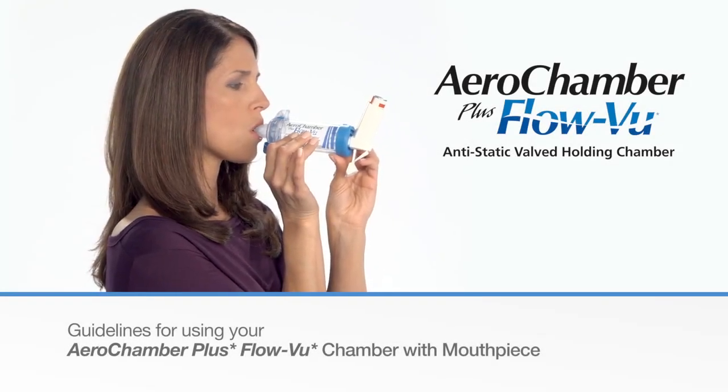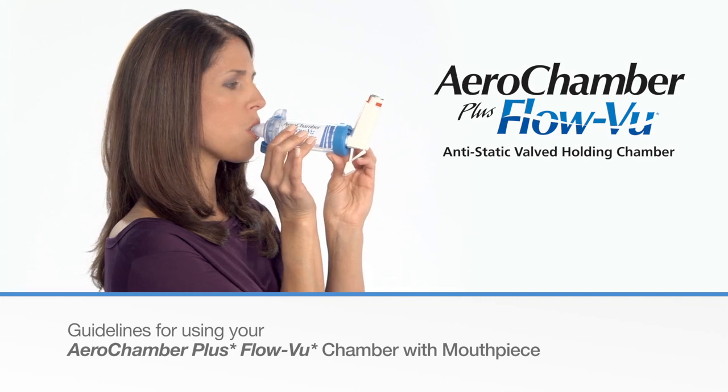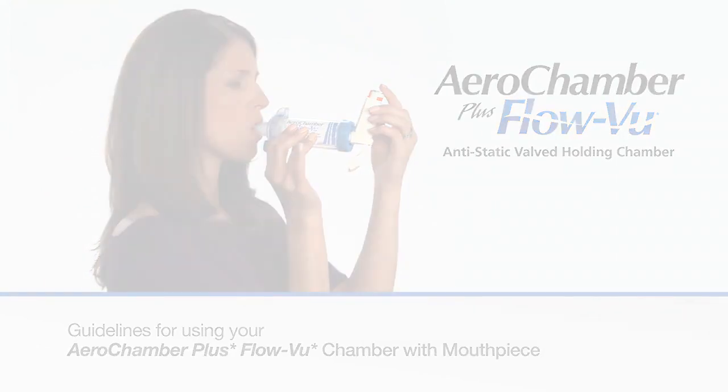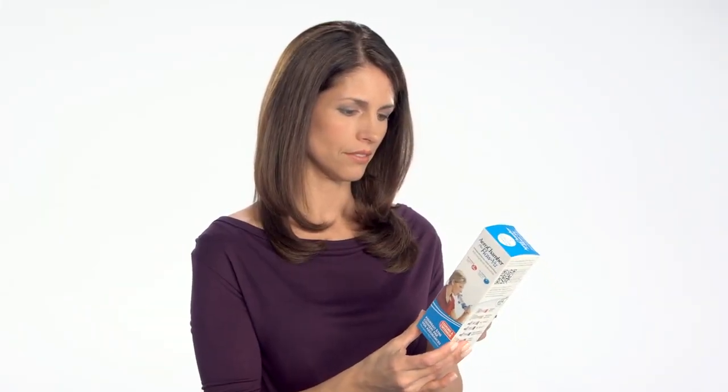Please follow these simple instructions when using AeroChamber Plus FlowView Chamber with mouthpiece for your inhaler medicine. The AeroChamber Plus FlowView Chamber can be used right out of the package.